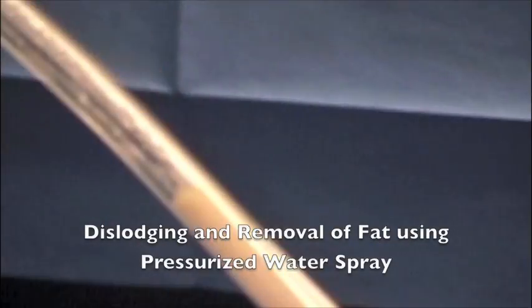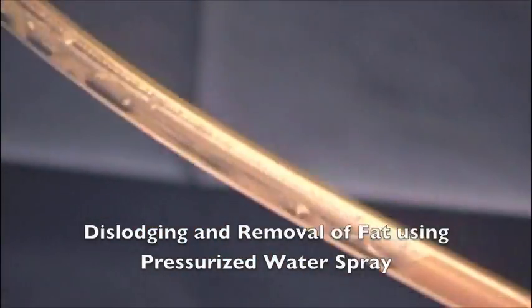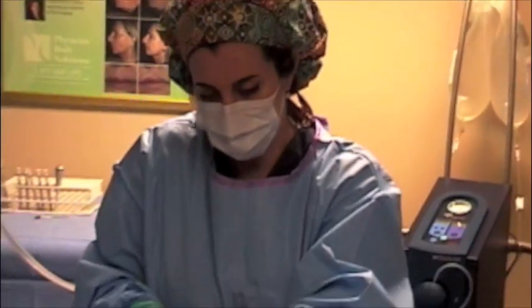So notice we're starting to take out Phil's fat. We've been doing this procedure about 10 minutes now. We already numbed him up with a little bit of fluid, and now you can see the nice yellow fat coming out of the area. This fat will be used to transfer to his face.